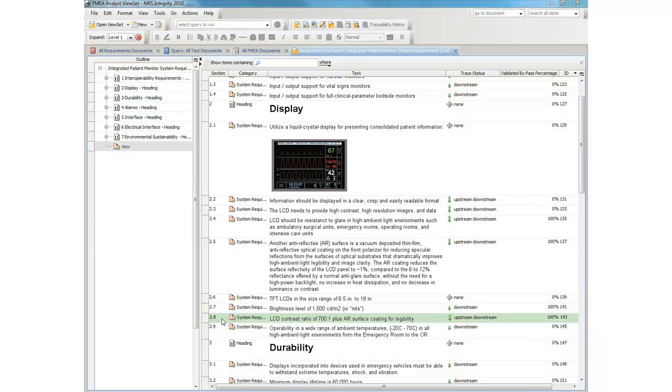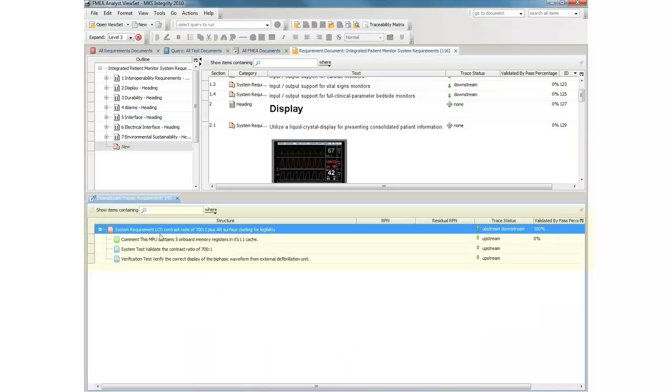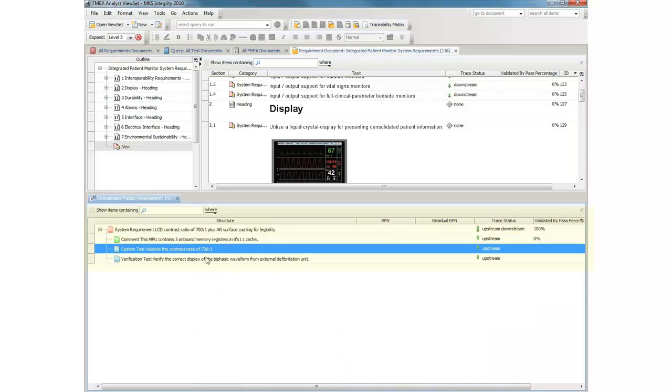We can drill down into the downstream traces for this requirement. And here we have a specification and two tests, a system test and a verification test.